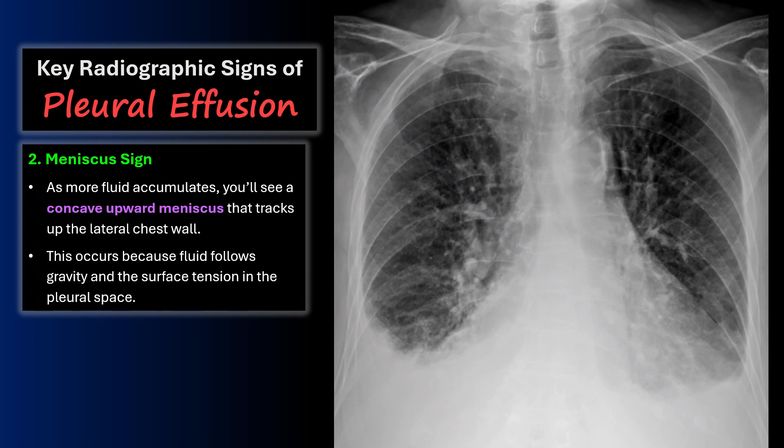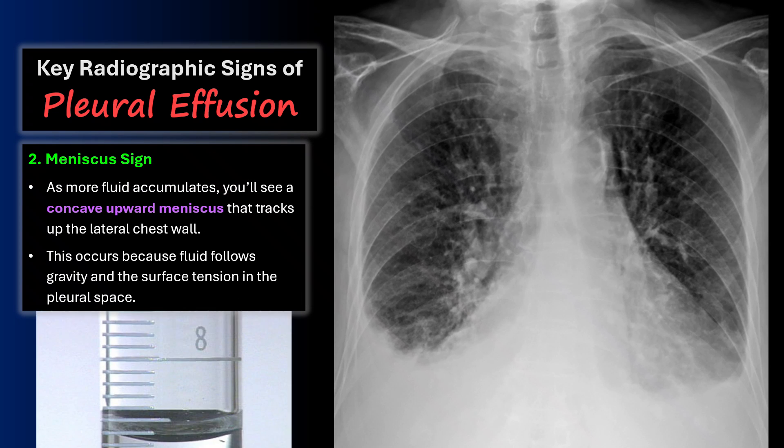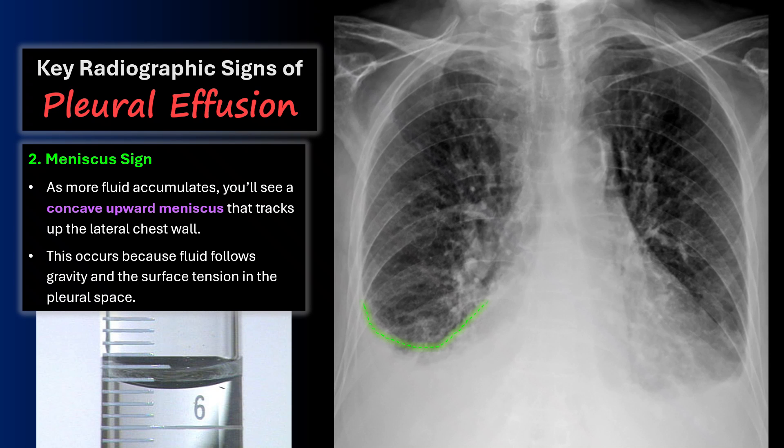Second, I'm looking for the meniscus sign. As more fluid accumulates, you'll see a concave upward meniscus that tracks up the lateral chest wall. This occurs because fluid follows gravity and surface tension in the pleural space, creating the classic meniscus sign.